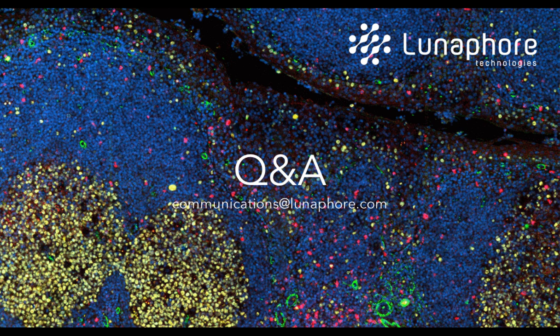We're going to do so by having a rather high numerical aperture objective in combination with a very high quality CMOS camera. As I mentioned before, we can target markers that are either nuclear, cytoplasmatic, or membrane. I don't think that with immunofluorescence we could go any further than that in general. Let's say an optics limitation.